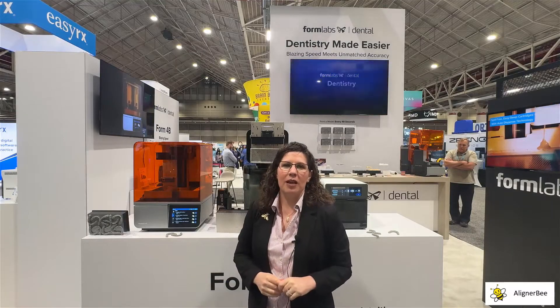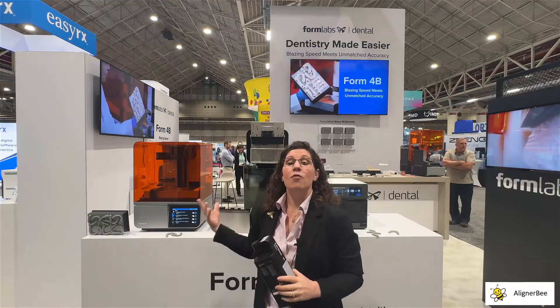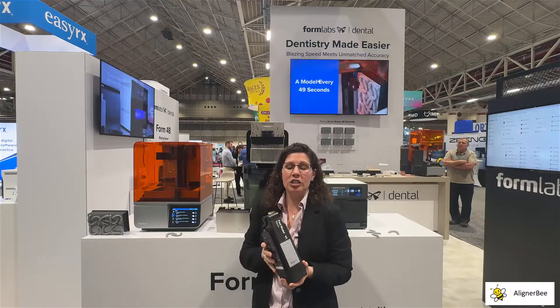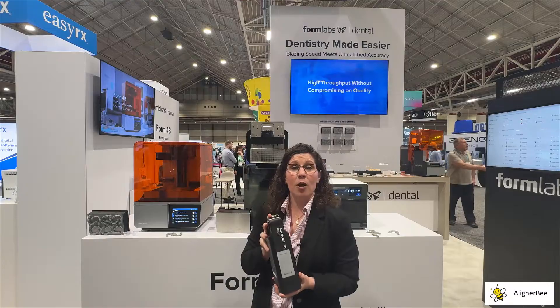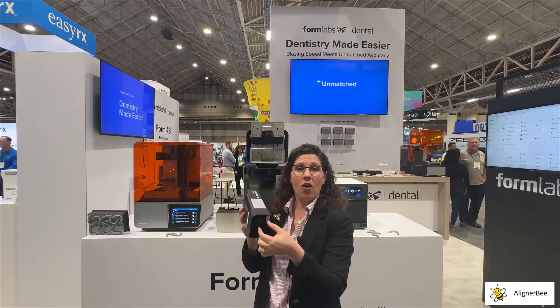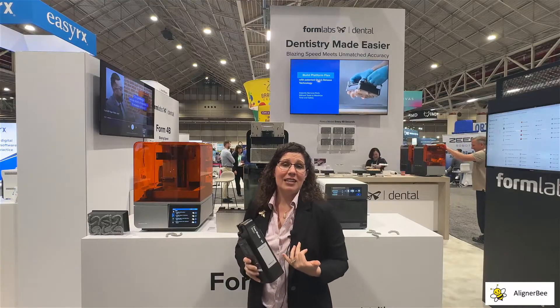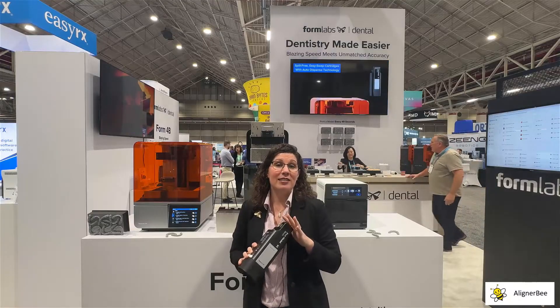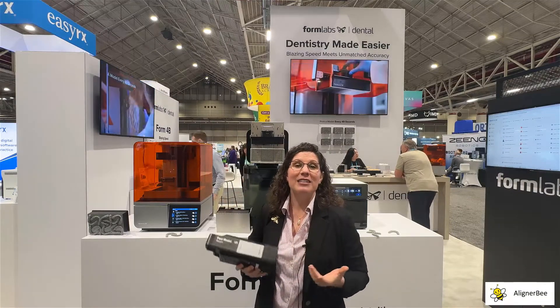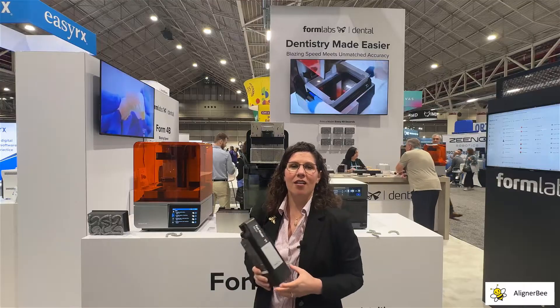One of Formlabs' commitments to the dental industry has been the reformulation of some resins for the new 3D printing system. The new resin cartridge size is great for storage — much smaller overall, yet it still holds one liter of material. The new valve design also allows for much quicker filling of the resin tank. I was most excited to hear about the reduction in resin prices for model resin. When doing high-volume printing in my office, it is rare that we see a price reduction in a material, and this is going to be a tremendous help in my workflow.